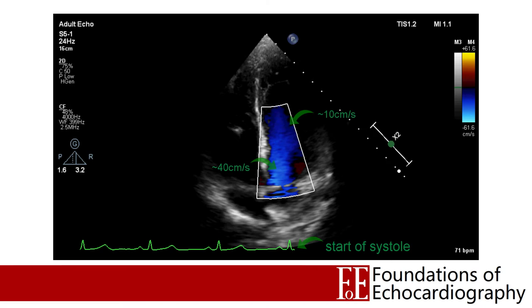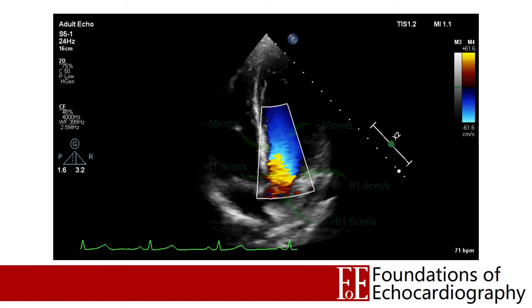Here we can see that systole is just beginning — we're just past the QRS complex on the ECG — and blood moving from the LV towards the aorta is displayed as a dark blue, initially moving relatively slowly. Because this is a healthy heart, the pressure inside the left ventricle rapidly increases and the velocity of blood leaving the LV starts to accelerate. As the blood is funnelled into the left ventricular outflow tract, it has a smaller and smaller area to pass through and so must accelerate. In the very next frame the dark blue gives way to brighter blue representing faster moving blood, and then this bright blue area suddenly flips into bright yellow — the blood has now accelerated beyond 61.6 cm per second and is now travelling too quickly to be correctly identified.